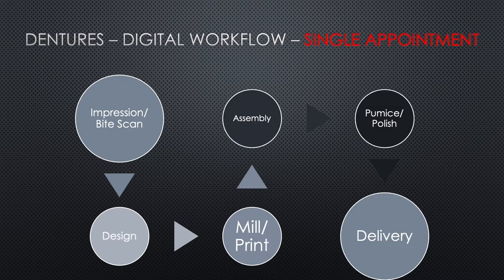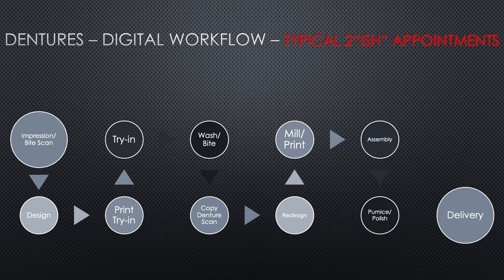So rather than this, and I don't recommend going to your dentist and saying, hey, we're gonna do single appointment dentures and introduce all this chaos in your life. Don't do that. But this is, you know, something that is possible with the advent of digital. I'd actually recommend kind of a workflow of like a two-ish appointment. So like maybe two, maybe three, maybe there's a wash in between, right? But with digital, this is a very common workflow of what we're going through for doing our digital dentures.